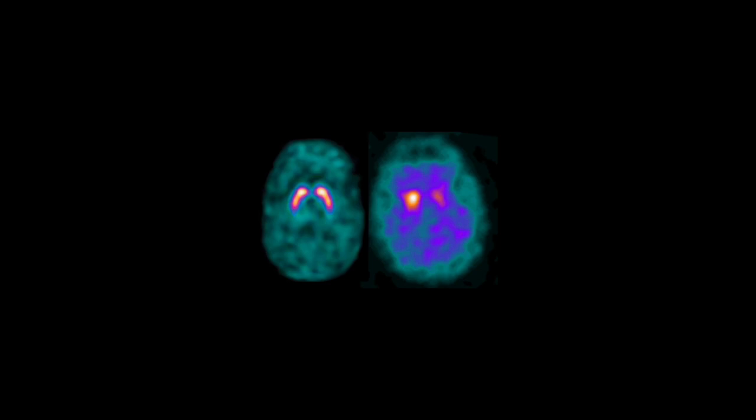Here's a picture of a normal DAT scan. You can see the caudate and putamen area light up as if they were commas. And here's a picture of our patient's brain.